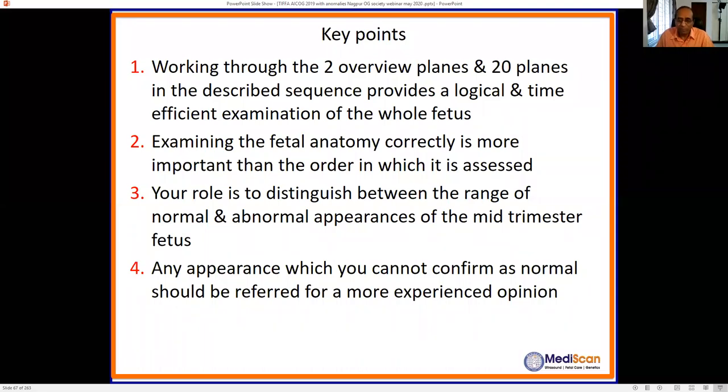If the renal pelvis is 7 millimeters, let us say, then it's fine. Then we can say, come back in 2 weeks time or 3 weeks time, I'll go and see whether the pelvis is increasing in size or not. But when the heart looks large, or there is asymmetry of the chambers, then I won't say, okay, come back after 4 weeks. By the time you've seen, the baby may go into hydrops. So we have to be careful about when to refer.